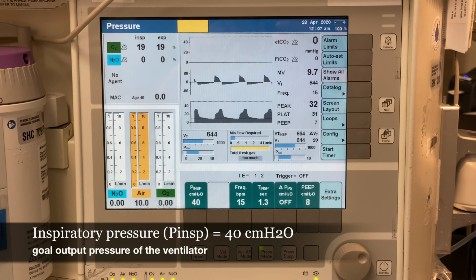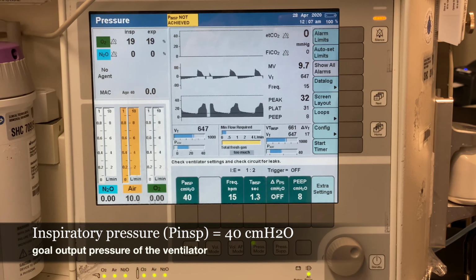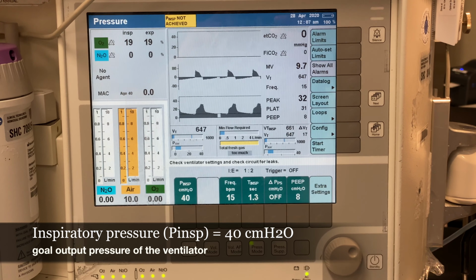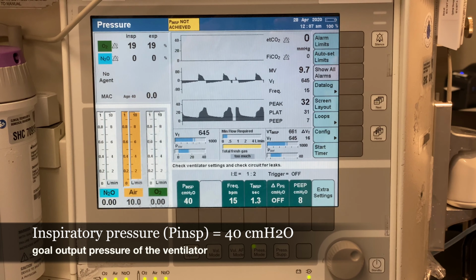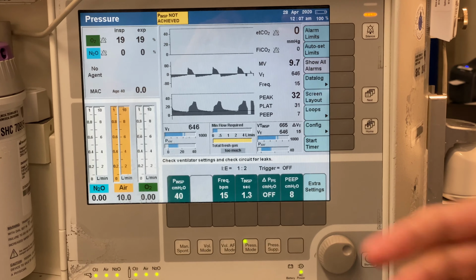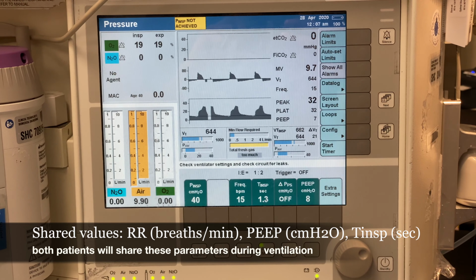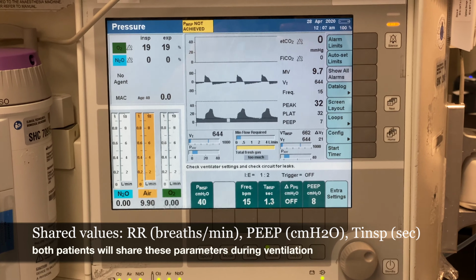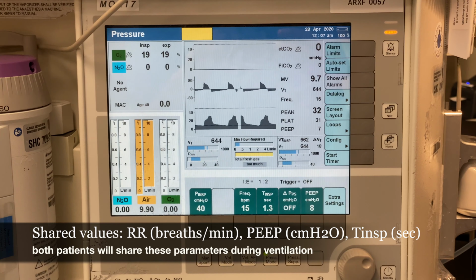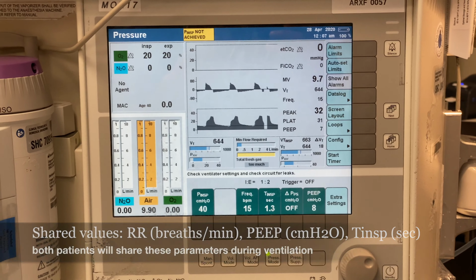The number doesn't necessarily have to be exactly 40 or any specific number, except that it must be at least the pressure that the patient with the highest demand requires. The respiratory rate and the PEEP, the inspiratory time, those will all be shared across the two patients. So it is important that their needs for those parameters are relatively matched.